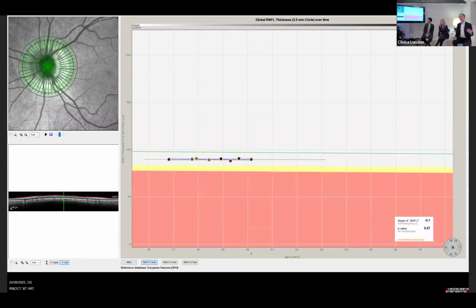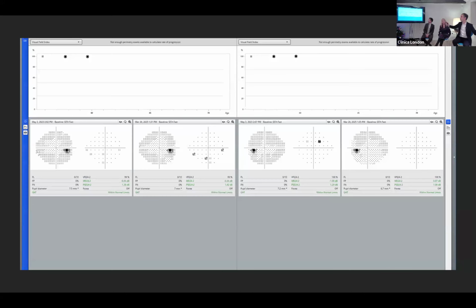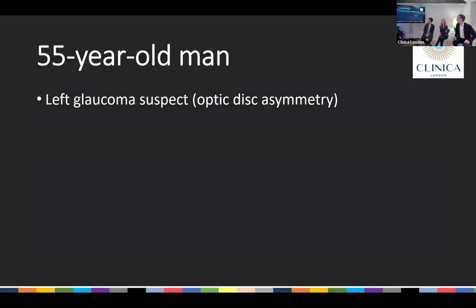So I think something that's changed, I would say, in the last 5 to 10 years is how good OCT is at looking over time. So you can confidently know before, and I should say her visual field, she never got a visual field defect. And so the changes that you see in the early stage, it's all on OCT, and it can give you confidence to not treat, like her other eye, or confidence to treat.